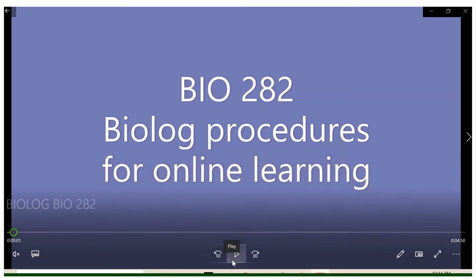Welcome to Bio 282. This is Biolog procedures for online learning. This video is meant to be paired with the other tutorial videos posted on Blackboard and also with the reading in your lab manual.